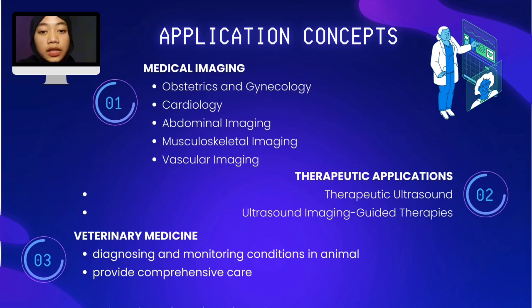Second, ultrasound imaging guided therapies. Ultrasound is combined with other therapeutic modalities such as focused ultrasound, drug delivery, and gene therapy for targeted treatments and personalized medicine. Last application is in veterinary medicine.